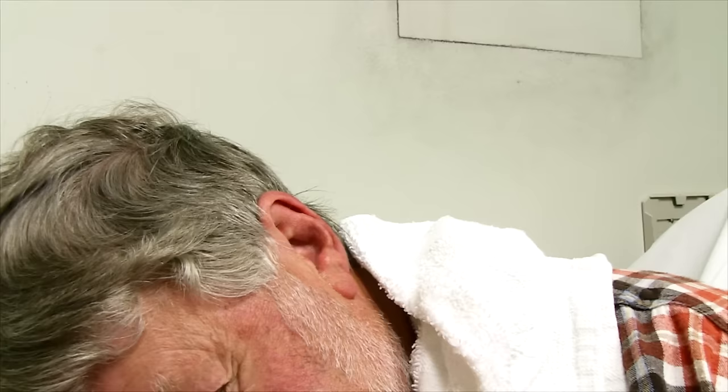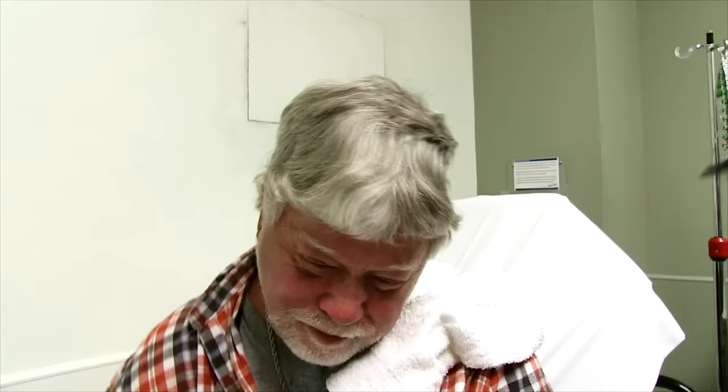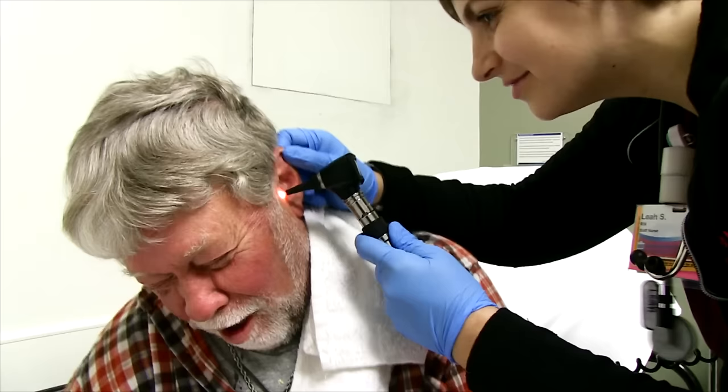I'm gonna see how that looks. Can you shake your ear out a little bit? We'll take a look at it. Be like an old dog, shake it up.